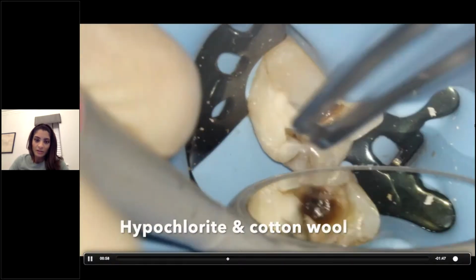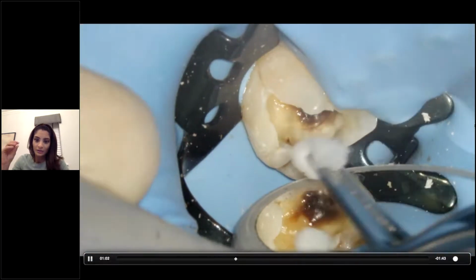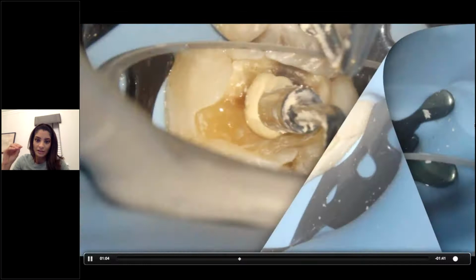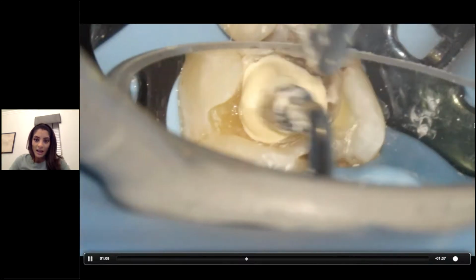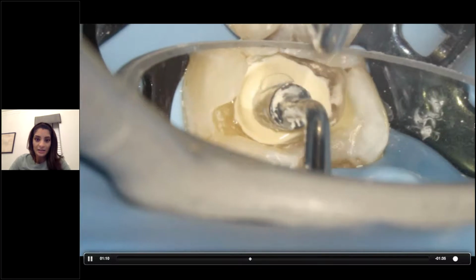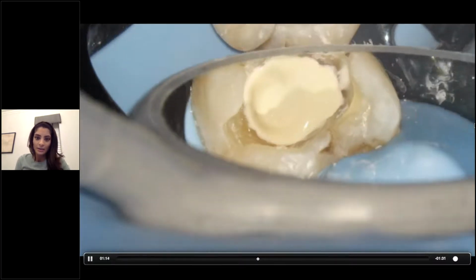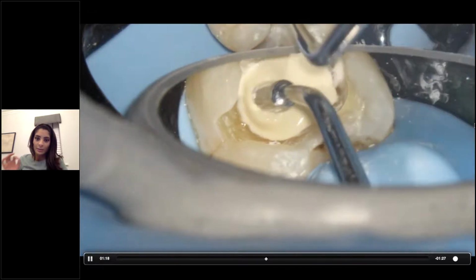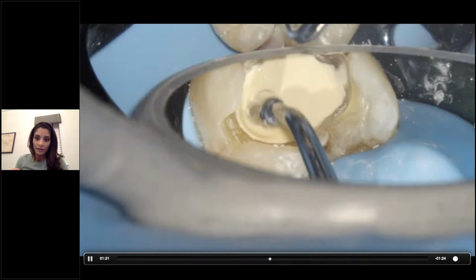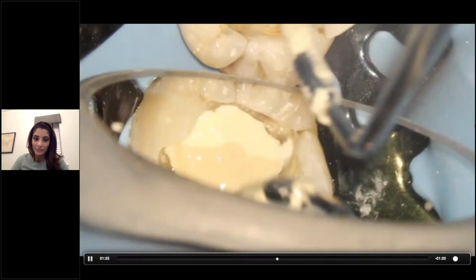And then I will generally always clean the cavity with a damp hypochlorite cotton pledget, just to get things nice and clean. And this is the first layer of biodentine that's gone in. What I've done is placed a tiny bit of the liquid of the biodentine just over where I'm going to be placing the biodentine, because then when you put the first increment of biodentine, it tends to spread quite nicely and it's a lot easier to handle.